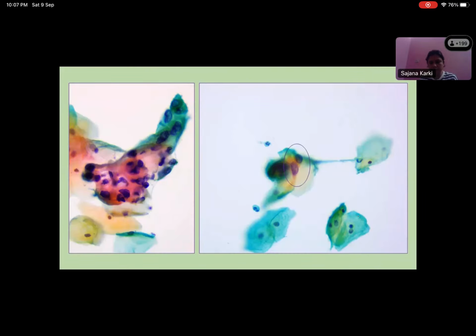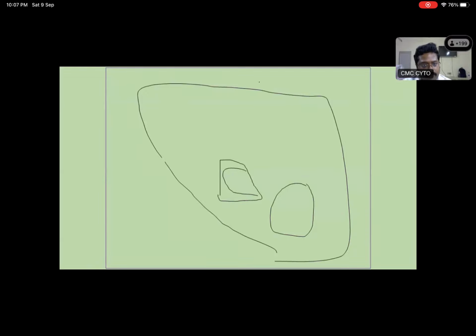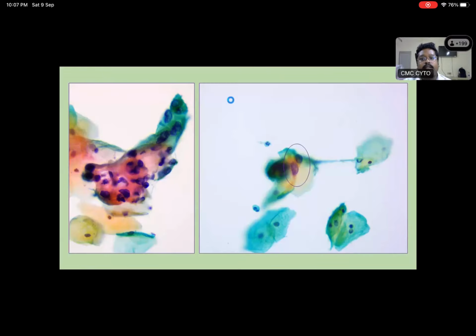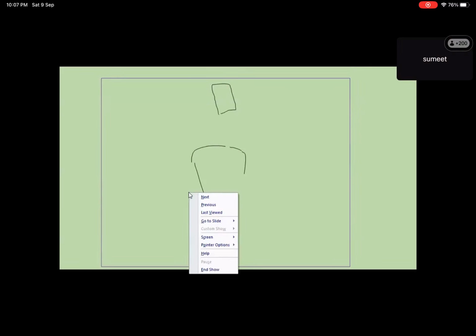Anything like that? Sir, it is having. Just a minute. Why is this tree? The annotation is there. Maybe you can click on the right, go back to the picture. Yes, sir. Right click and remove that. Just erase all.